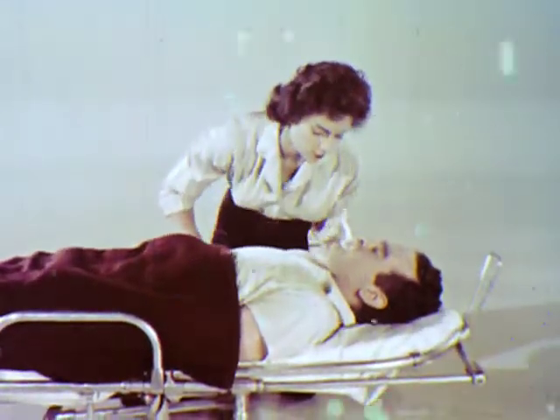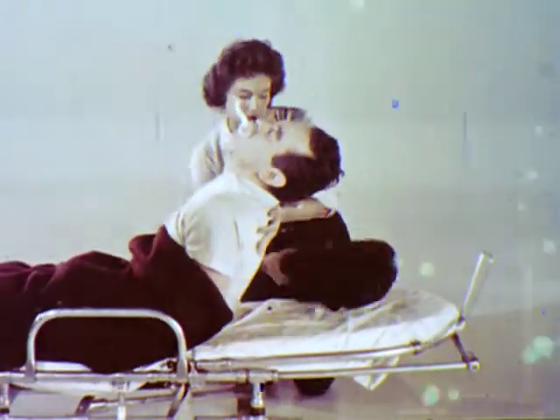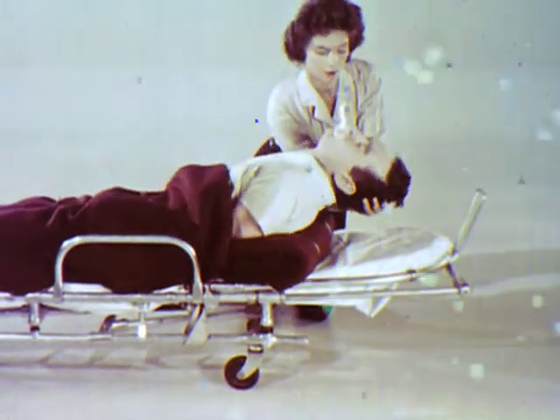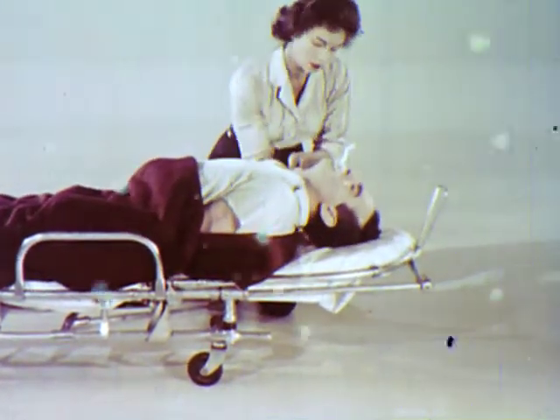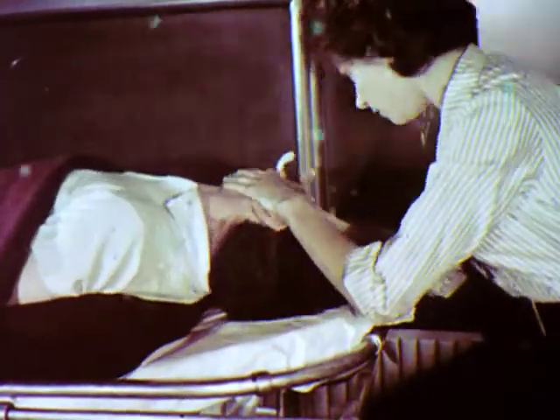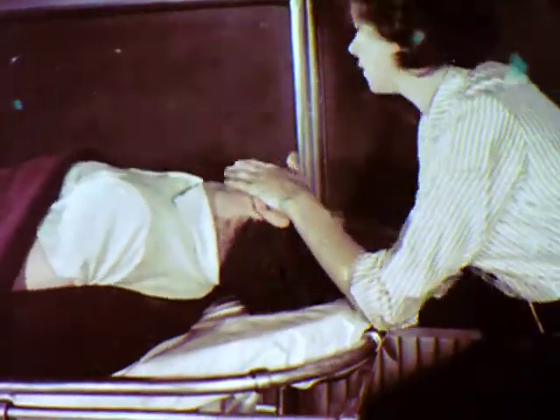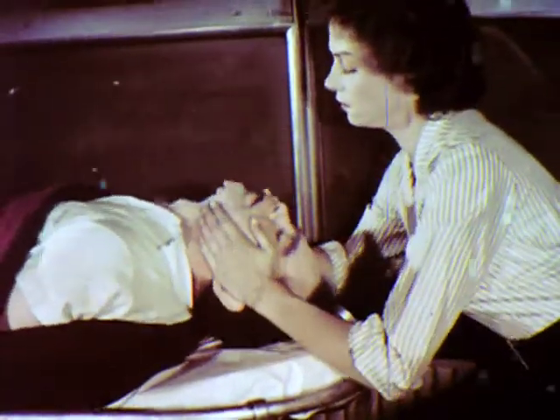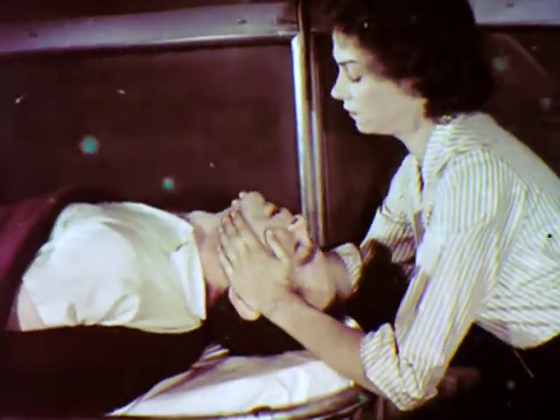When he is breathing and you are transporting him, elevate his shoulders so his head is tilted backward and leave the resuscit tube in place. Be prepared to blow into the mouthpiece if he should stop breathing. Or when the victim reacts by gagging or retching, remove the airway to prevent vomiting. Keep the head tilted backward to make sure that the air passageway is open.